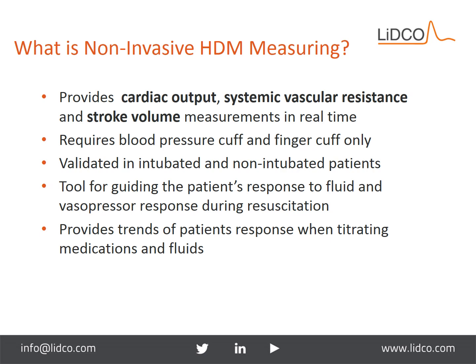Why is this different from our traditional measurements of blood pressure, heart rate, pulses, mental status, urine output? Well, it's different because it's in real time. It's measuring as it's happening to the patient. The other traditional measurements, while extremely important to get a global picture of the clinical presentation of our patient, remain important. This dives a little deeper into answering the question we ask every single day with every single patient at the bedside, and that is, is our patient adequately perfusing?